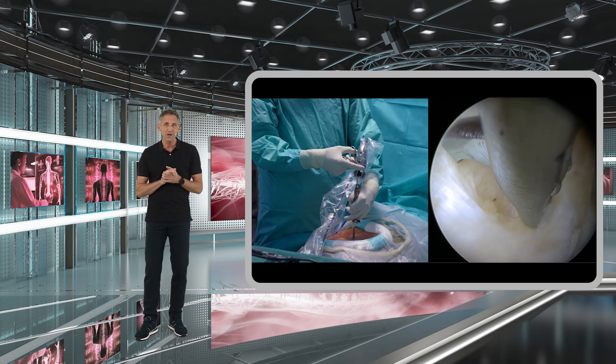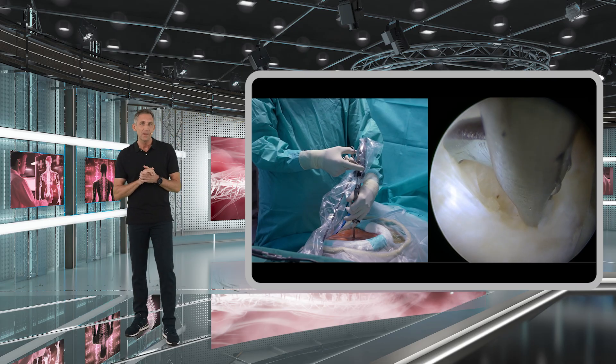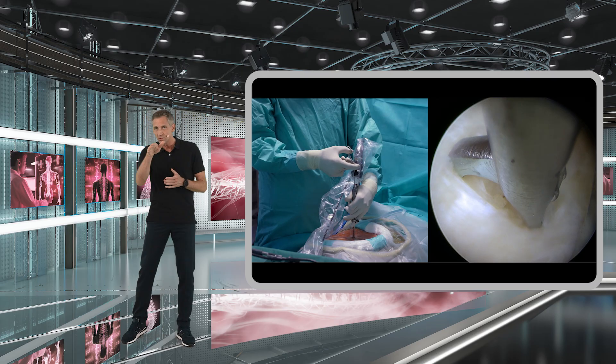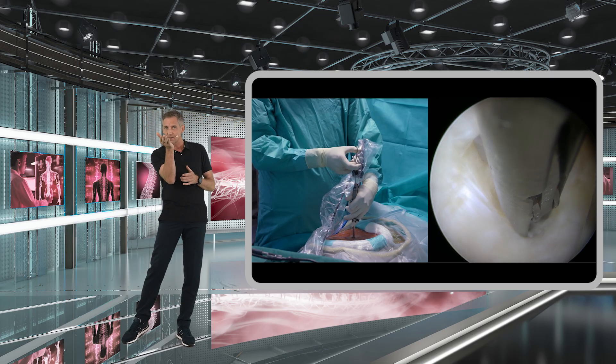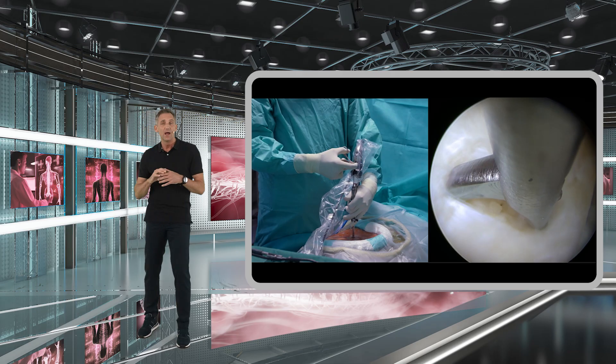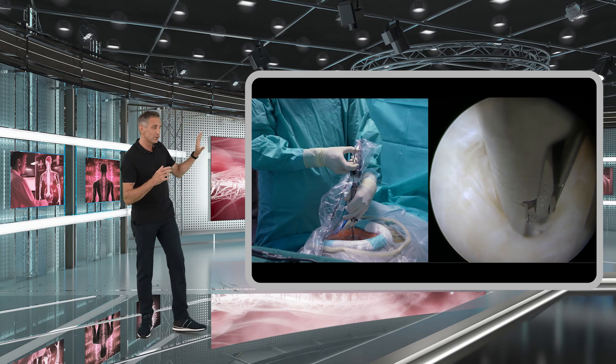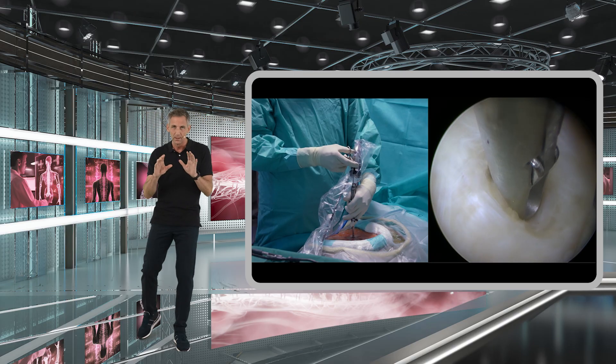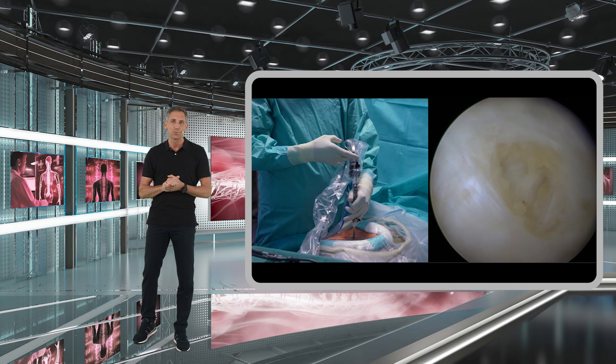There is one simple trick: you can make use of your 25-degree angled optics. Simply rotate the 25-degree angled optics by 45 to 90 degrees and this will give you a perfect visualization of where you are and what you are doing. That's what I recommend.